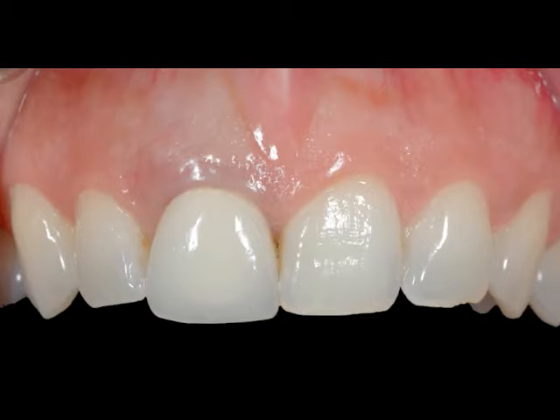Video. This is the pre-op clinical picture. The right central incisor is the tooth of the problem. It is fractured and it has a cyst mesially. It also has a not so aesthetic restoration as we see, and we're dealing with relatively thin tissue biotype.